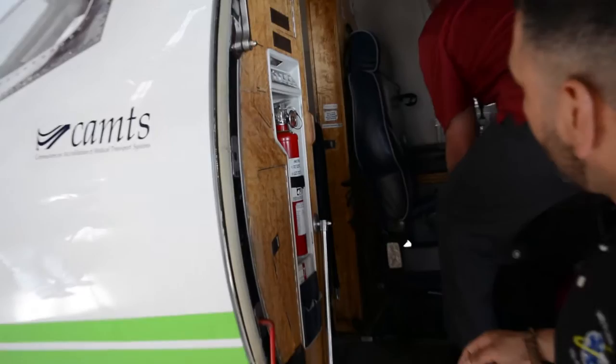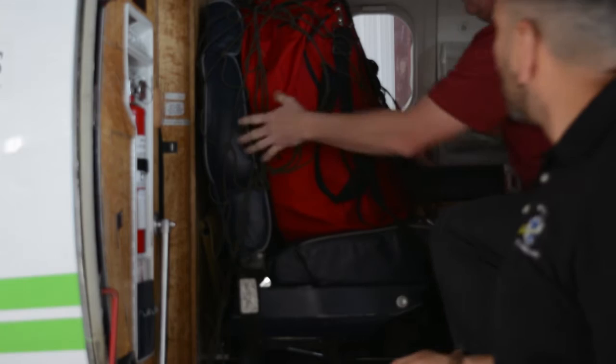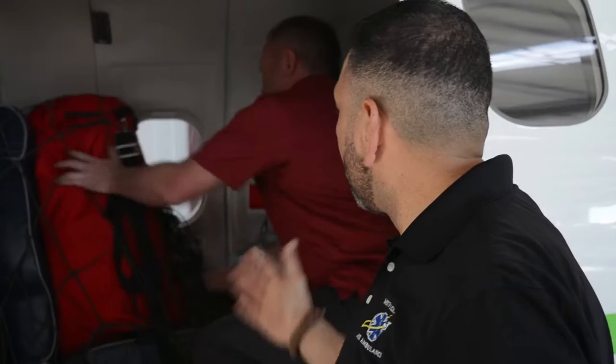So Aaron has put the seat cushion back into place. He's setting up the red bag here. We've utilized our little eyelets here. We have one eyelet here and one in the back, and there's two on the back rail against the wall, and then you have one up here. So we can properly secure this whole red bag with the cargo netting and any other loose backpack. Sometimes the pilots have their flight bags with them, and we could put under the netting.